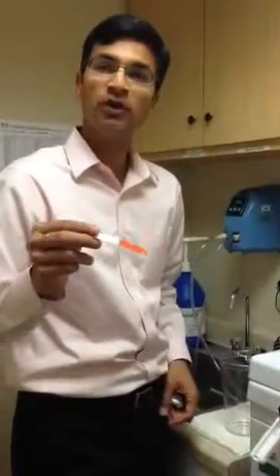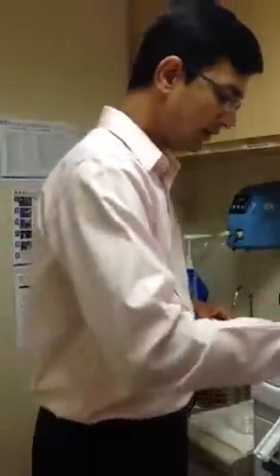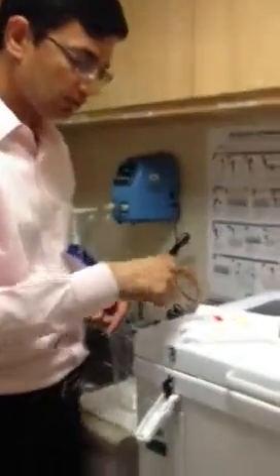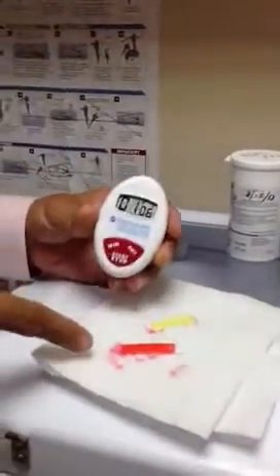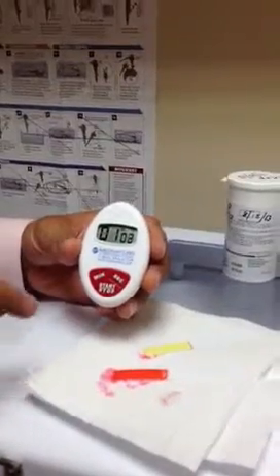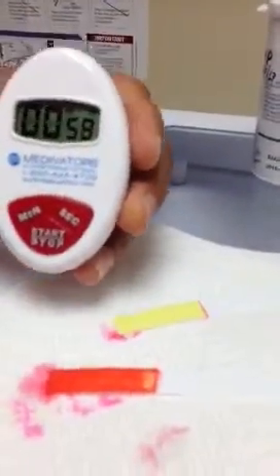You will think this is positive, but you have to wait for 75 seconds. I'm going to leave it here and now see what happens to this over time. Come closer. As time goes by, note what is happening to the strip. What you would have thought is a positive result — please note that the color is changing to a speckled form.